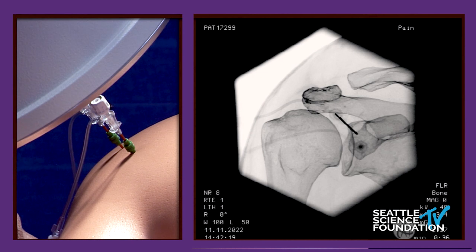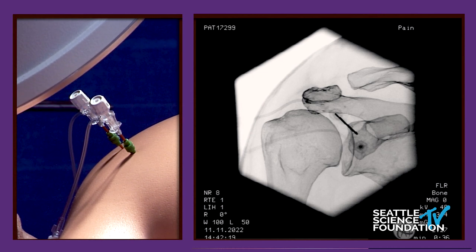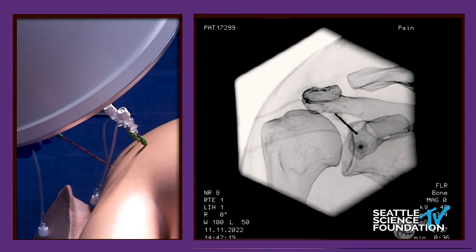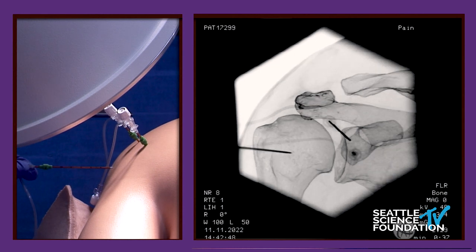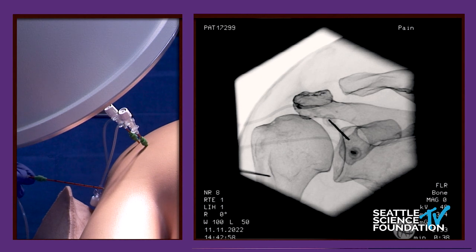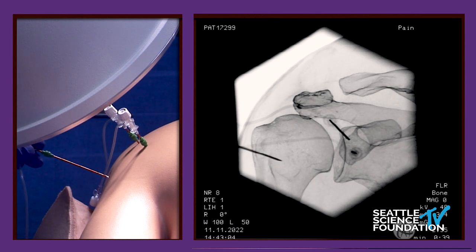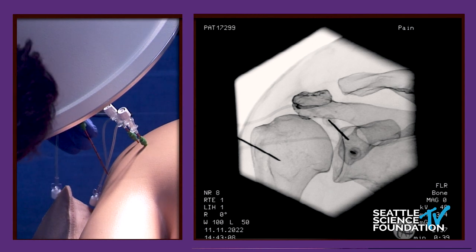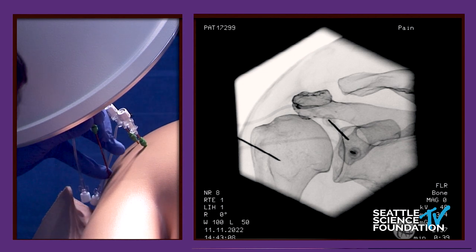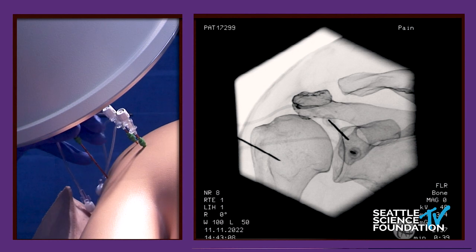So then what we would do is we would test. Gavin's going to go ahead and start doing the axillary nerve while I talk. For the suprascapular, we test with motor stimulation at two hertz, looking for any suprascapular nerve motor twitch. And if we see that, we would adjust — head more superior or cephalad to avoid some of the motor innervation. Because as that nerve comes across, it branches out, and you're catching the sensory branches only going into the glenoid fossa. Now where he is, we're going for the axillary nerve. You can see the neck of the humerus — that's our inferior border where we do not want to go with our needle because what is there? The circumflex artery. So we want to avoid that. We want to stay cephalad or superior to that.